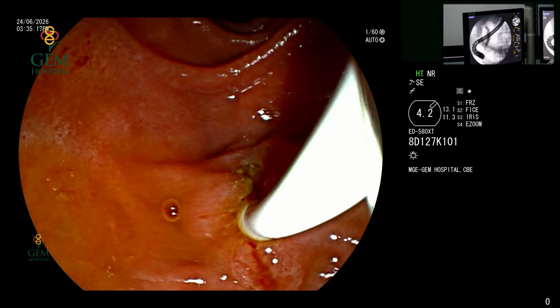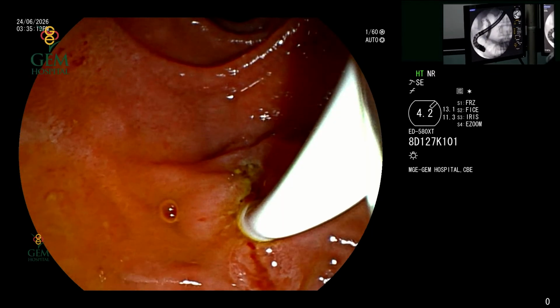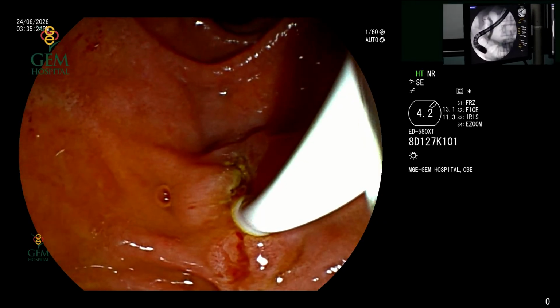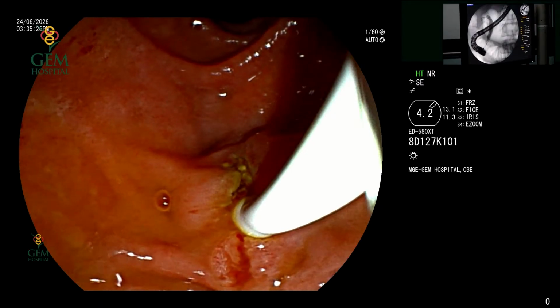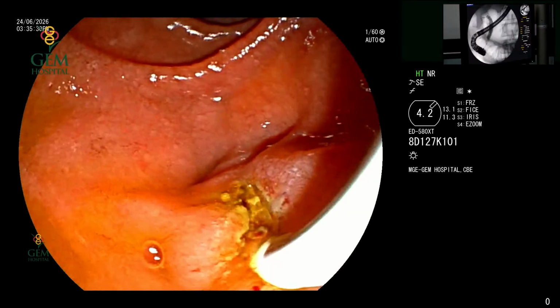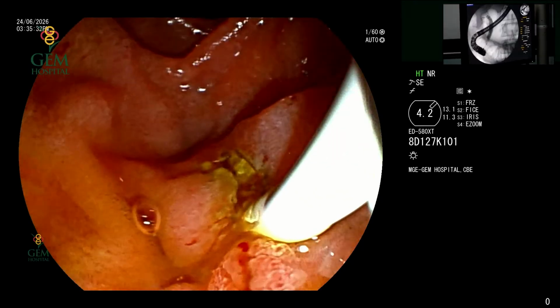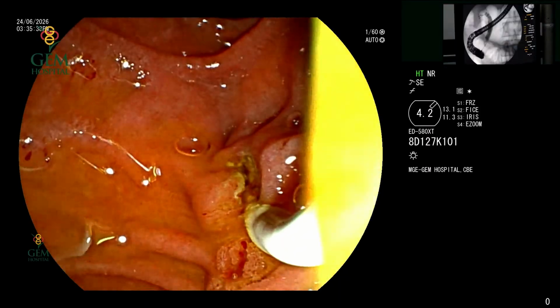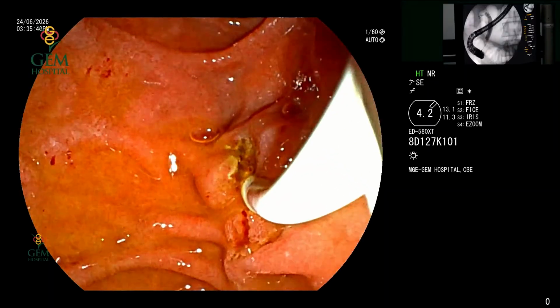It could have been a cystic duct stone that would have fallen later on, and because of the tiny little stricture or the periampullary diverticulum, the stone wouldn't have come out. It's such a tiny stone, possibly 3 to 4 mm. As per the MRCP evidence, we have a 5 to 6 mm stone, but our cholangiogram more precisely says it should be a bit smaller stone.